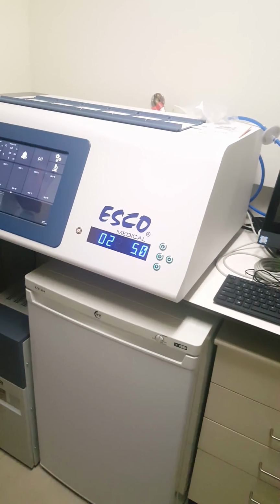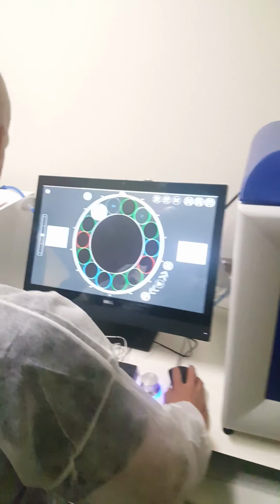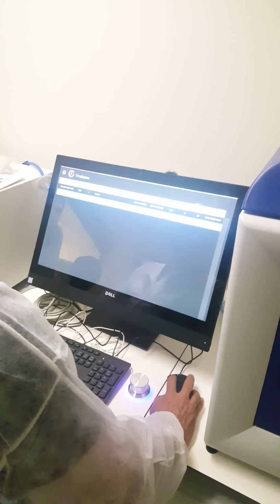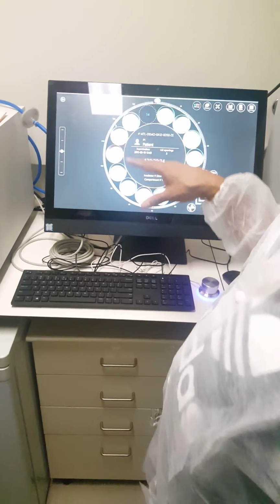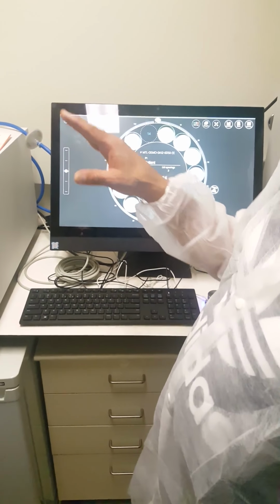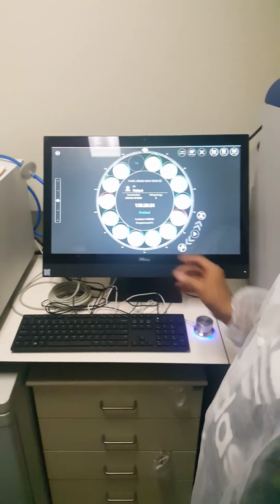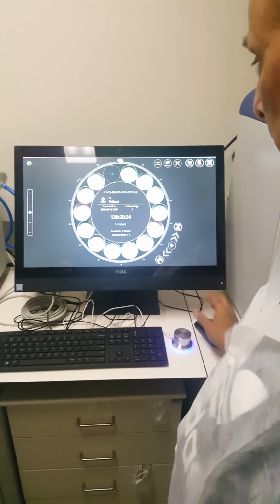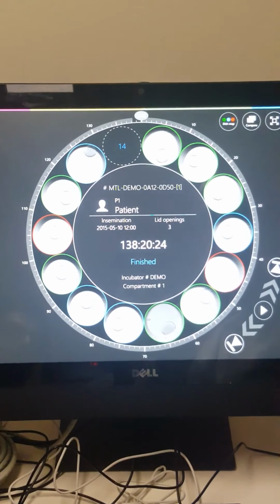And just to show you, this is a presentation. So this is one plate, one cage, and it's taking the picture in a circle because the camera is going around, and you can see 14 embryos, and I can give you an example of this embryo.